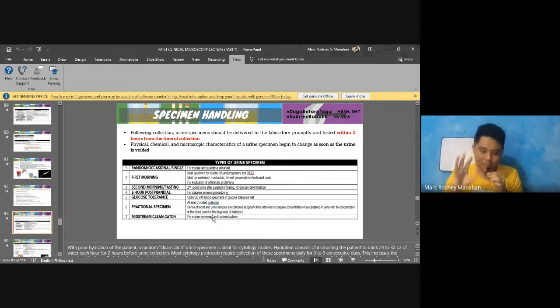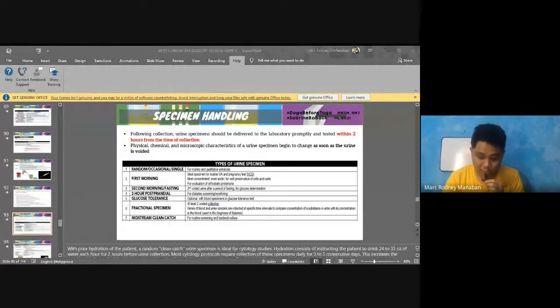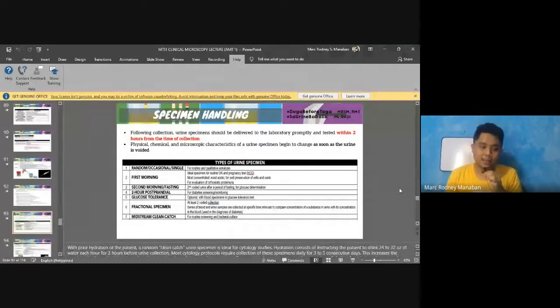So proper instruction to the patient. How do you instruct the patient? Sir, ma'am, palihog, imuhang tunga-tunga lang sa ihi ang imuhang isalod. Alright? Ayaw isalod ang unang ihi, tunga-tunga lang na mugawas ang imuhang isalod. Okay? Ina na itong instruction ha. Basta midstream clean catch. Okay. Alright. Take note of that, dears. Kaya mo instruct mo na sa patient, especially if mato mo sa mga public hospital. So, Bisaya gyud, no? Bisaya gyud. Ma-challenge nyo ang Bisaya dito. Pero carry naman. Okay? Alright.